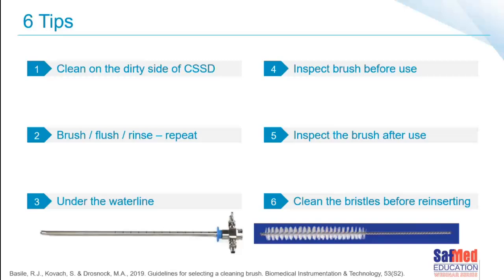So coming to look at some of the tips of what will be the most effective way to clean and to brush. Clean on the dirty side of the CSSD, of course you know that. We speak of brush, flush, rinse and repeat, a very effective method of using your brush. Always cleaning under the waterline, of course, to prevent the aerosolization of microorganisms. Inspecting the brush before use to make sure it is actually clean and correctly functional. Inspecting the brush after use to make sure that it is clean and functional. Hopefully you haven't lost any bristles and they're not down the lumen. And cleaning the bristles before reinserting it when we are cleaning.